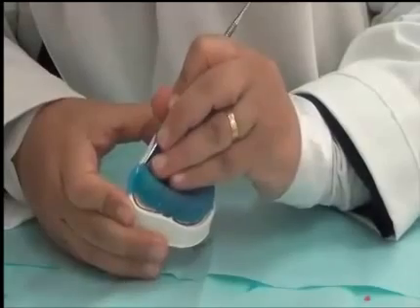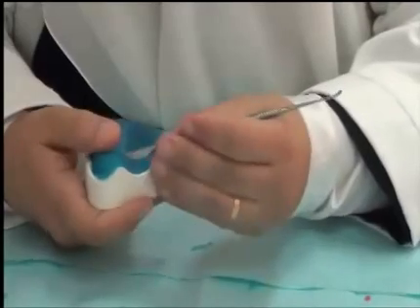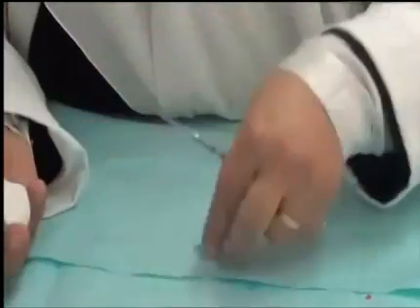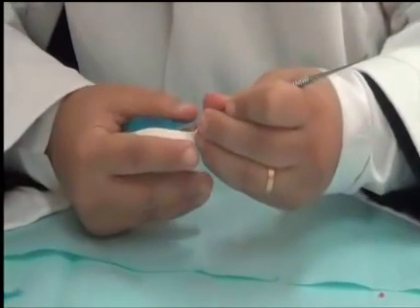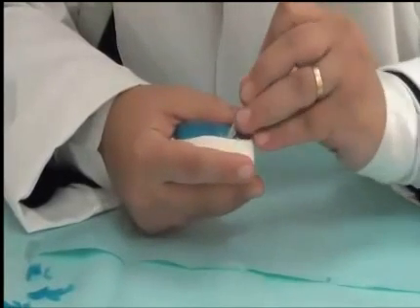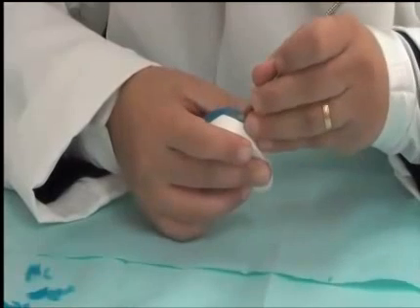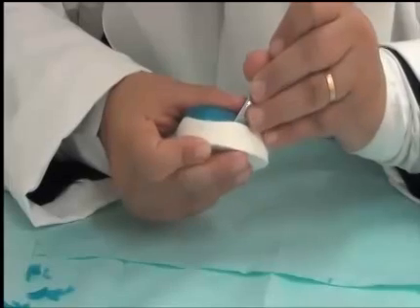We have the material inside the hamular notch, straight to the other hamular notch area. So it's included in the borders of the tray. You can see that we're taking our time because the material will stay soft and could be adapted all throughout the time until we light cure it. But that doesn't mean that you work with it for a long time, because the light from the room itself might initiate some reaction. So it's better to finish it off as soon as possible.